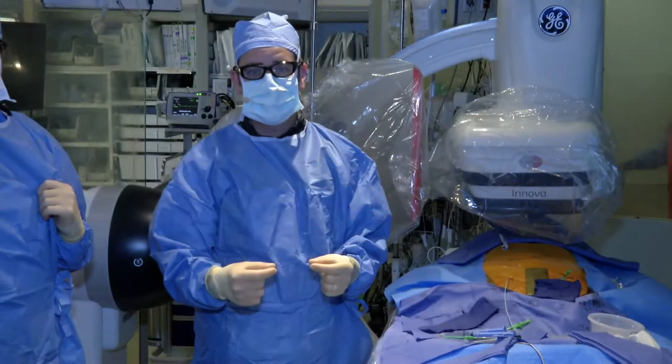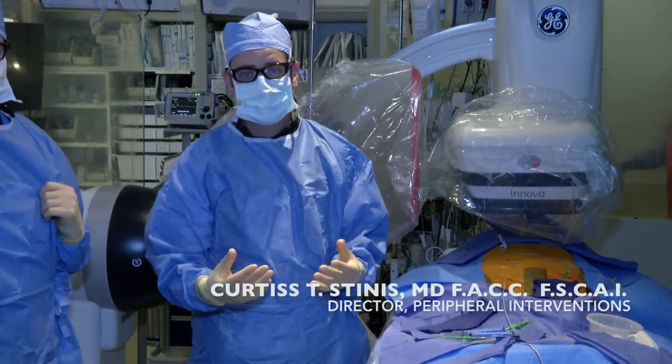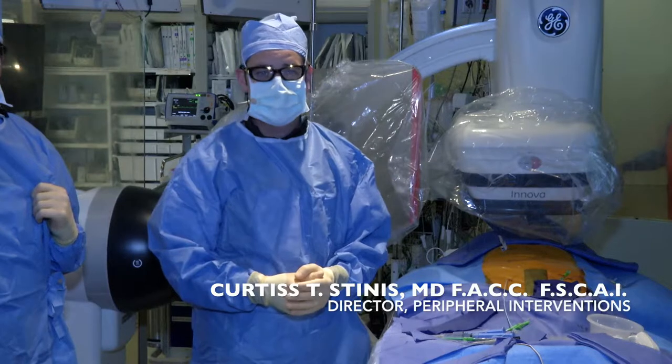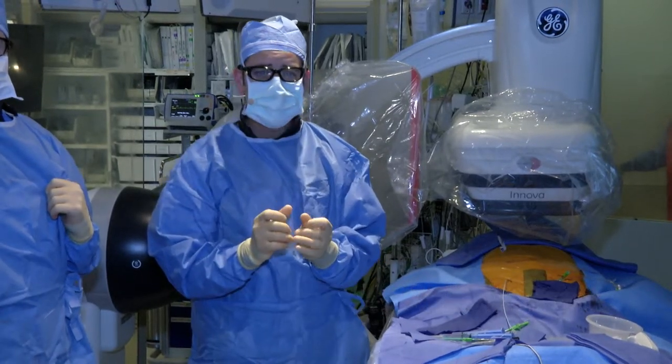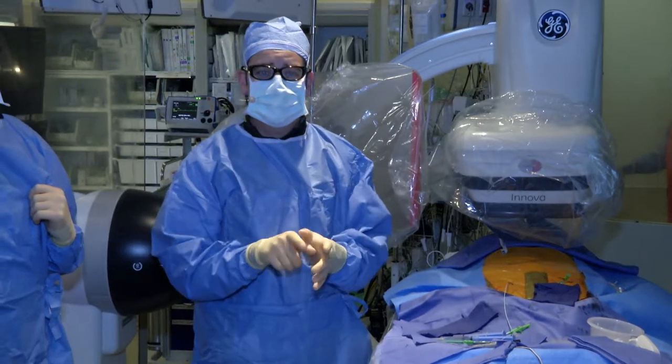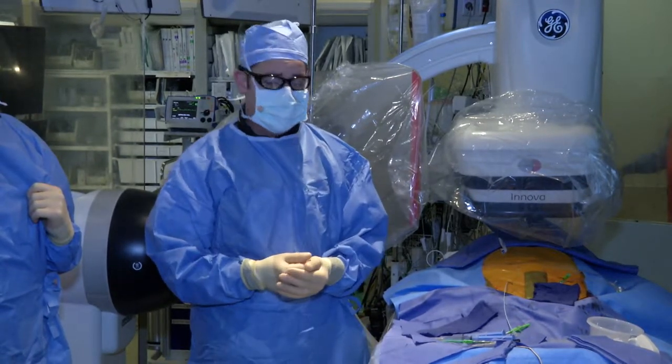And that increases the morbidity for the patient, increases risks of infection and pain and things like that. So we do things percutaneously. So it's a very small incision. And the way we do this is we use a device that stitches the artery from the inside out, basically.